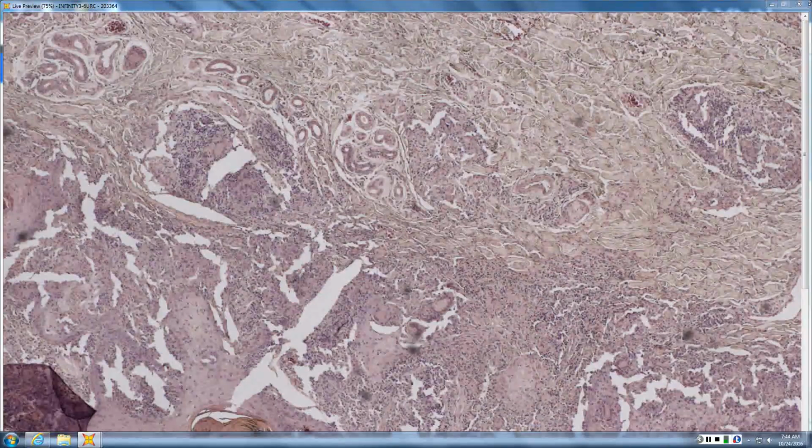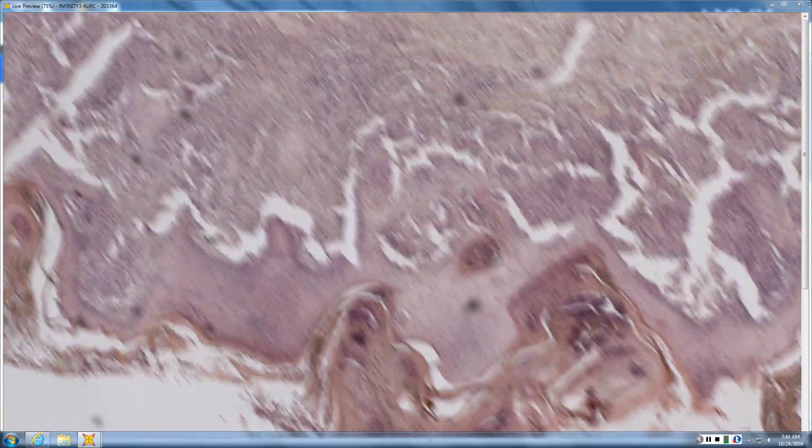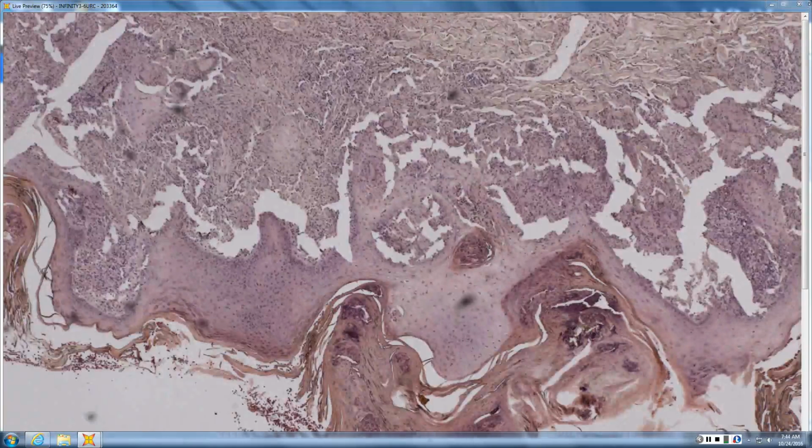So infection would be your top things. So this was a patient referred in for sarcoidosis. You see this pattern, now you're really thinking infectious. Deep fungal, so PEH with pus. You have, here come big green leafy veggies, halogenoderma, but granulomas uncommon.